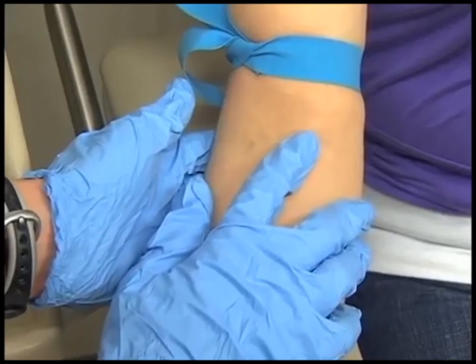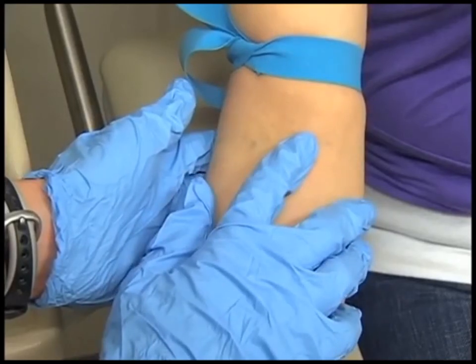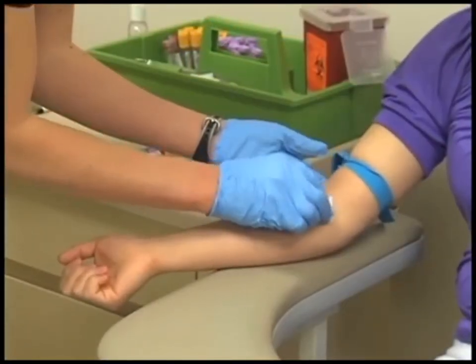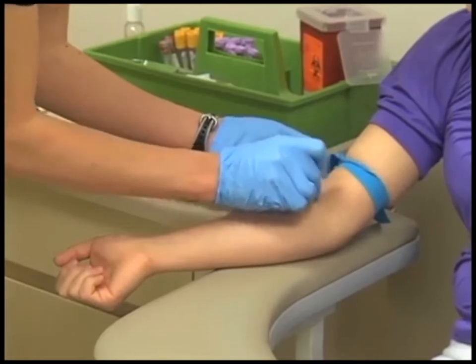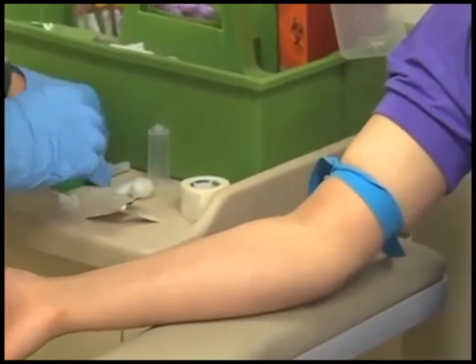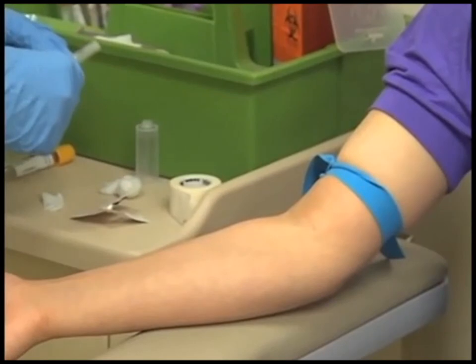Thoroughly palpate the selected vein. Gently palpate with the fingertips to determine the direction of the vein and to estimate its size and depth. Cleanse the site with an antiseptic wipe in a circular motion starting from the inside and moving away from the puncture site. Allow the site to air dry. After cleansing, do not touch the area.